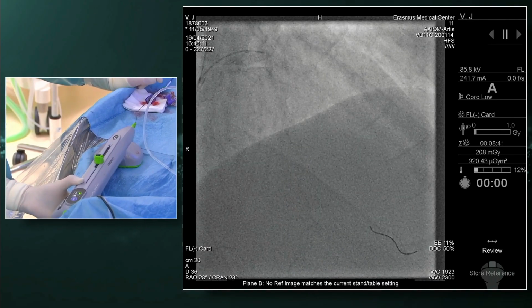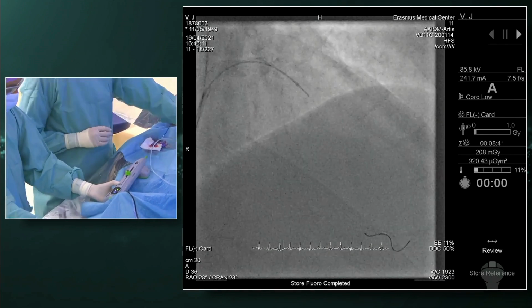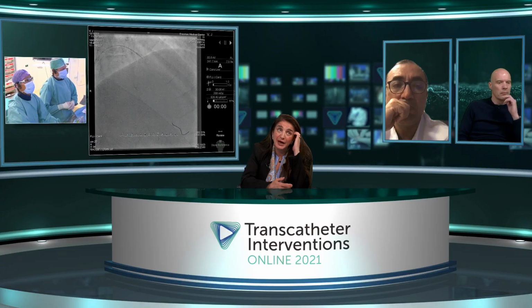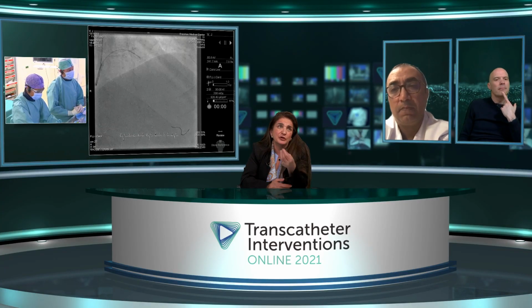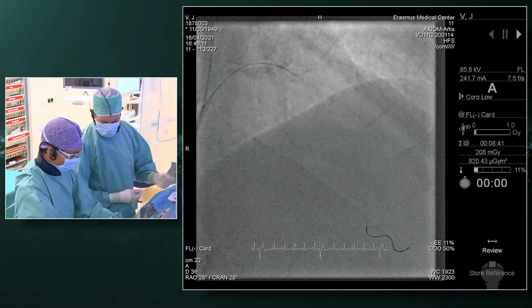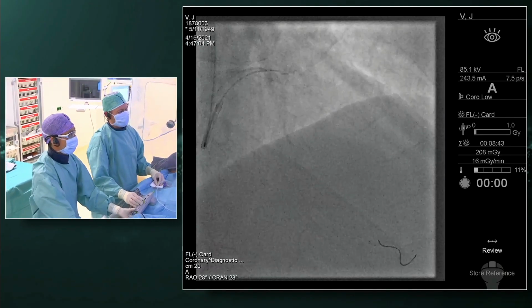Alrighty. So what we'll do is that after the orbital, and that I think would be another. You can keep going if you feel like you haven't done your, how do you feel? How does it feel? How is it moving through? It feels good, and that is, I think, what we've learned with this device is that it moves and it tracks very well.